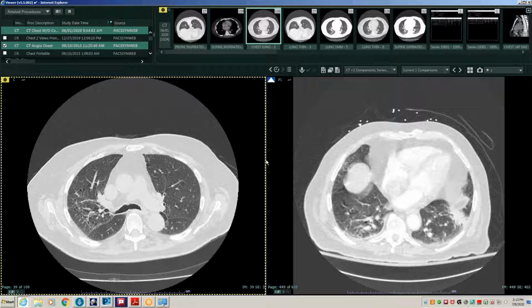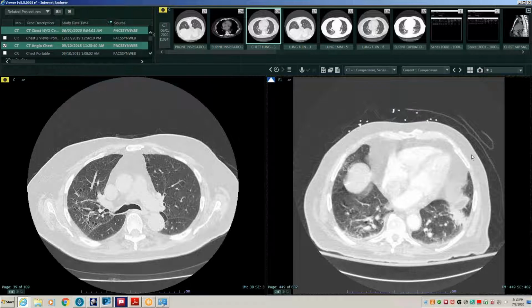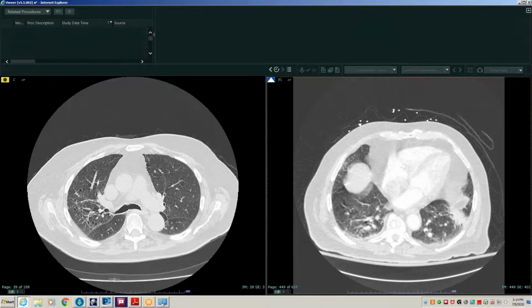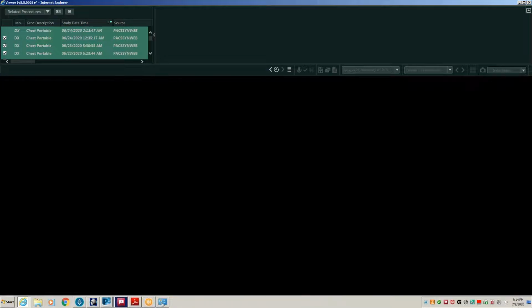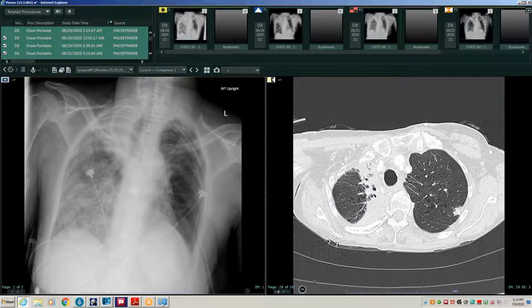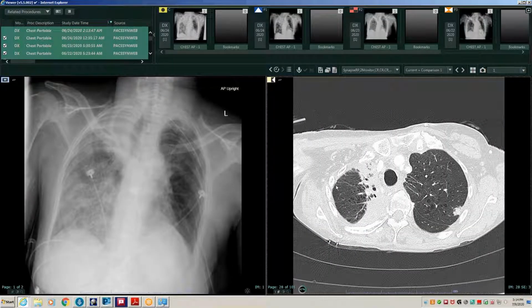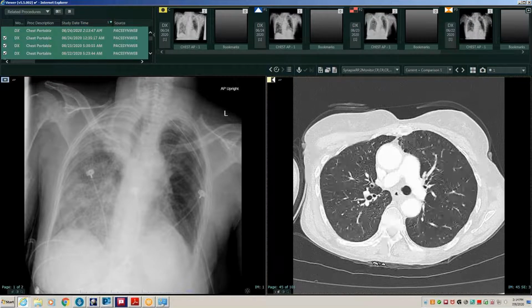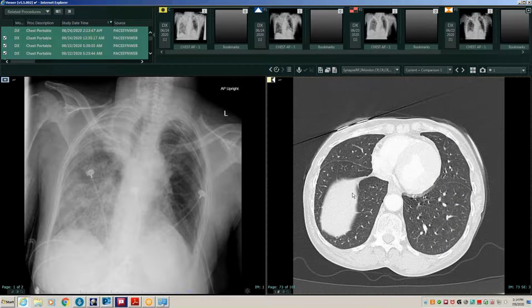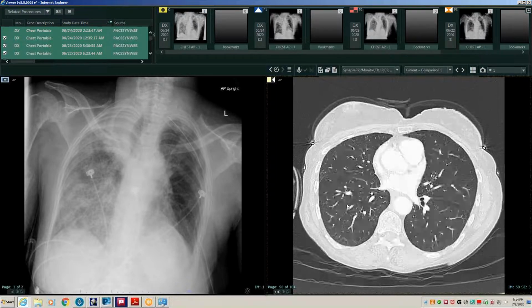So, okay. And my last case is an interesting one. This is an entity I had not heard of and found quite interesting. So this is a woman who is in her 60s. She previously had a lung cancer, which you can see was treated with radiation. So there's quite a lot of post-radiation change and chemotherapy. That had been, I don't know, multiple years prior.